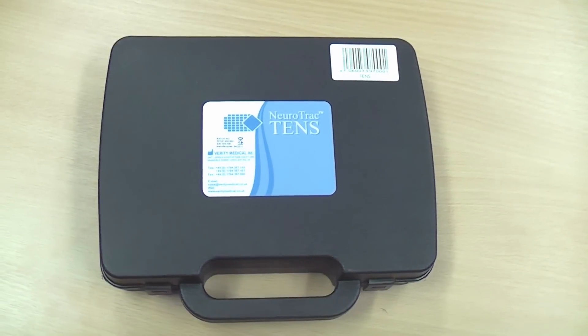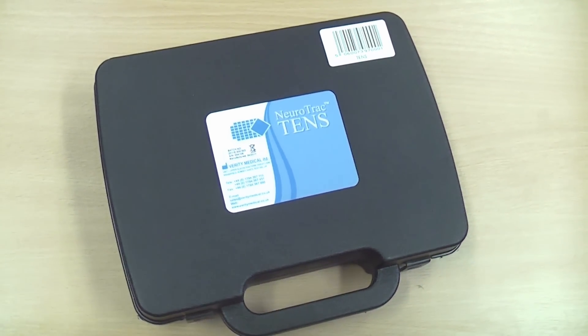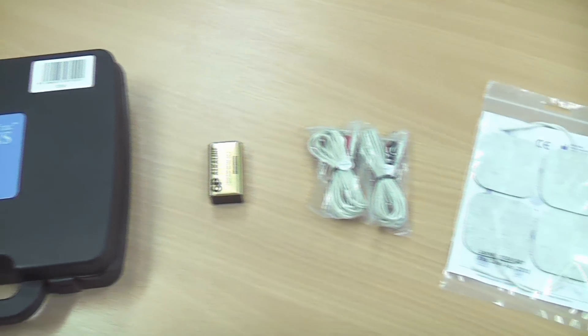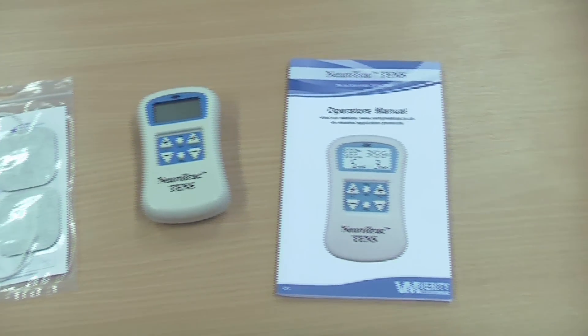After buying one, everything you need to use the device comes safely inside an easily cleaned storage case: one battery, a pair of lead wires, a pack of electrodes, the device itself, and a manual that should be thoroughly read before using the device.